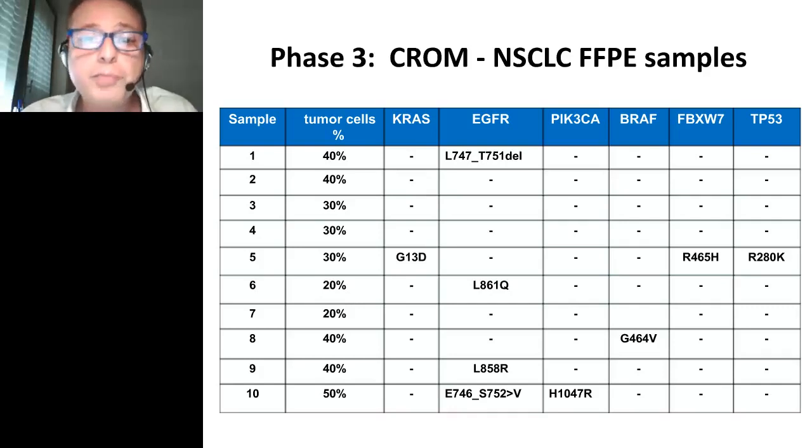When you use these panels, sometimes you find some surprises. This is what happened for us when we analyzed the 5 colon carcinoma samples. One of the samples, number 15, was found to carry a mutation in KRAS. That was confirmed; we knew that this sample had a mutation in KRAS, but we also detected in this sample 2 mutations in the EGF receptor, the T790M in exon 20 and the L858R in exon 21. So this was a big surprise for 2 reasons.